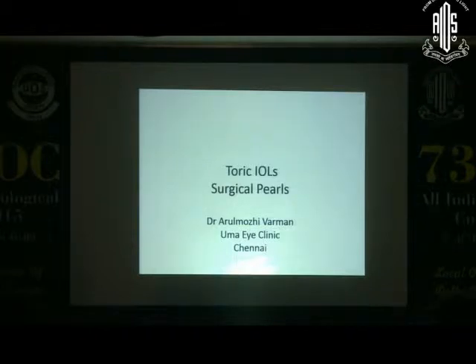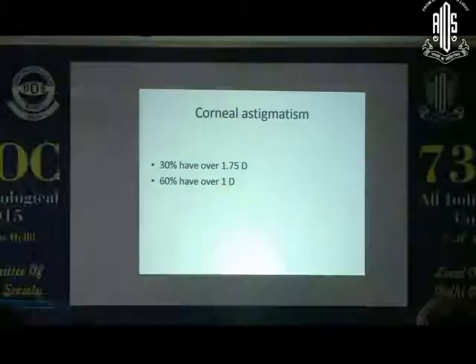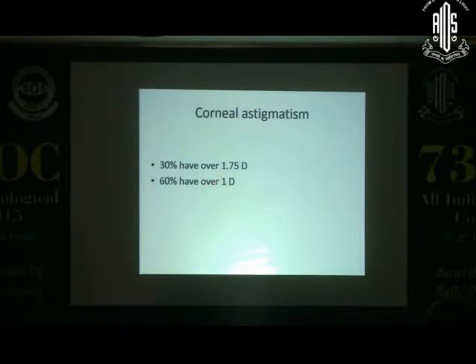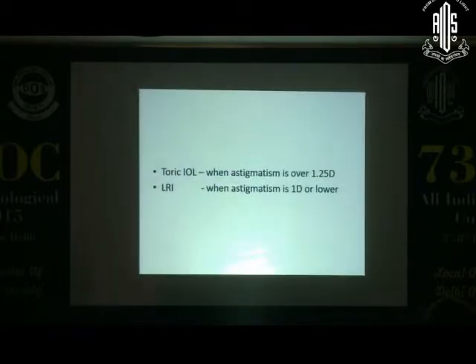Okay, I will be talking about implanting toric IOLs and the surgical pearls. As I mentioned earlier, depending on what your cutoff is, whether it's 1 diopter or 1.75, almost 30% of our patients would have about 1.75 diopters of astigmatism, which earlier was not addressed, or we tried using LRIs. Now we can use toric IOLs and correct it very accurately.